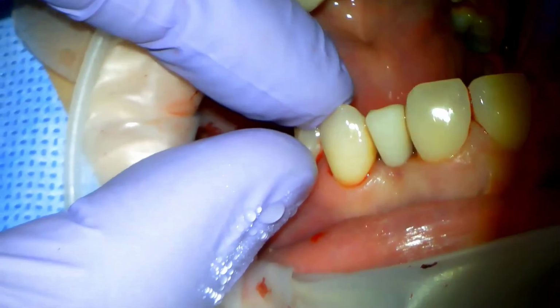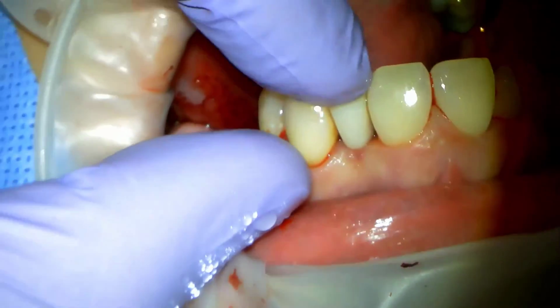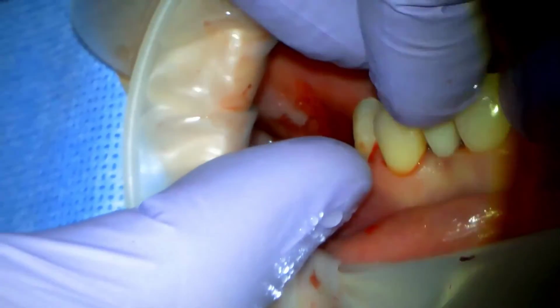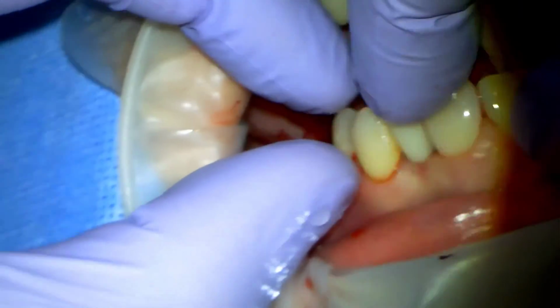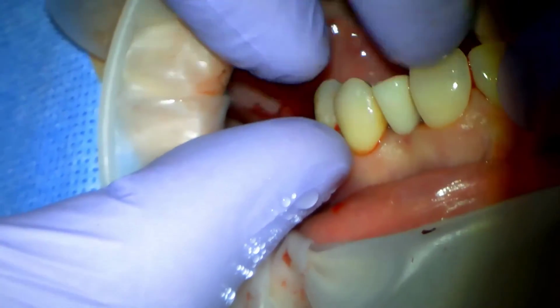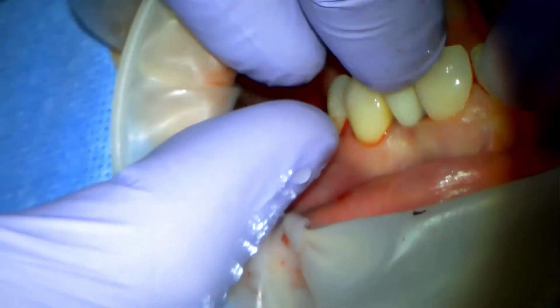So there's the crown in place. Again, our color is close. It's a little bit lighter. I'm going to go ahead and floss these contacts. No proximal contact adjustment has been done. Let's see how they look. No marginal adjustment was done. I decreased the height just a little bit of the lateral. It was a little bit long.